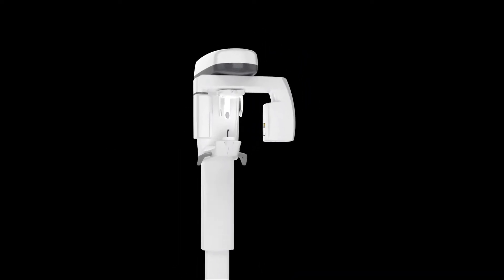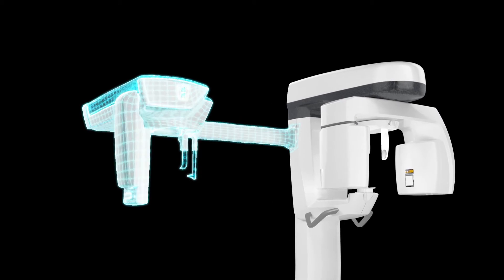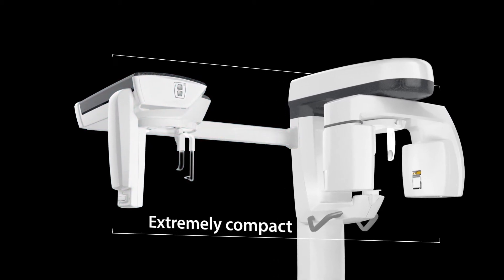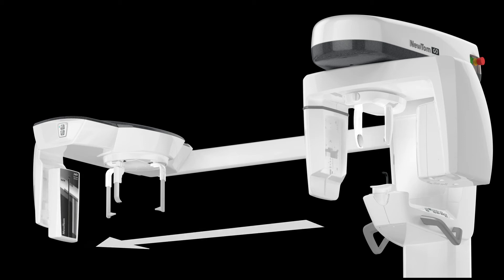The CEPH application will extend your 2D capabilities to a full range of cephalometric examinations. Either choose to integrate it at the time of purchase or foresee the retrofit available on the CEPH-ready version. Compact and available with a relocatable PAN CEPH sensor if desired, a secondary collimator is featured.